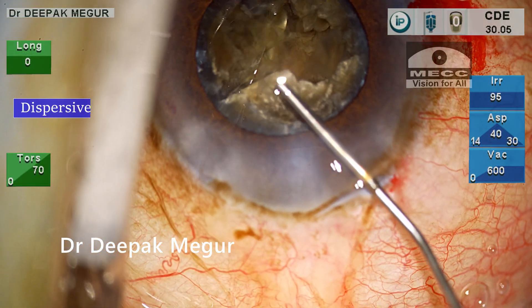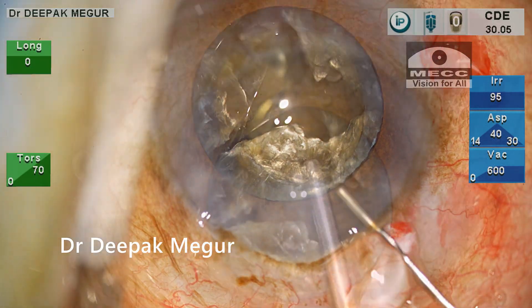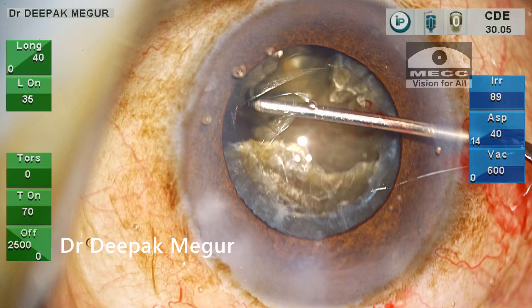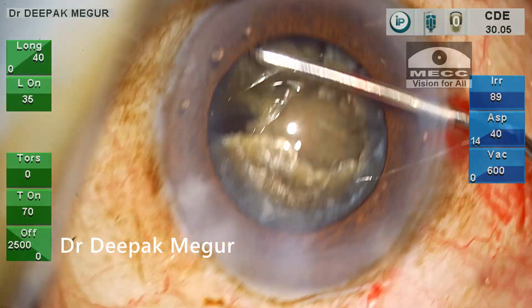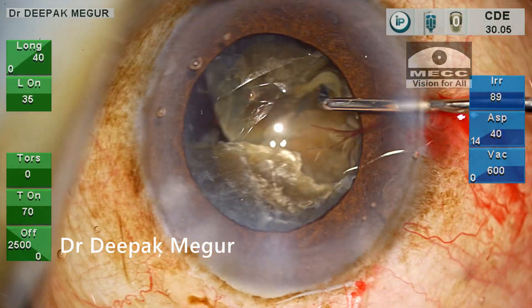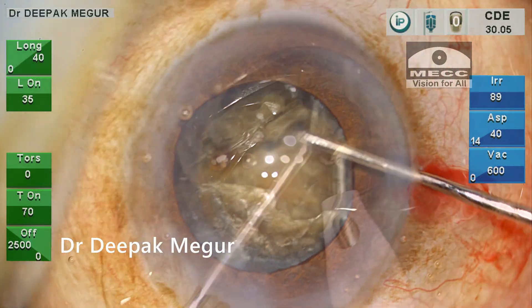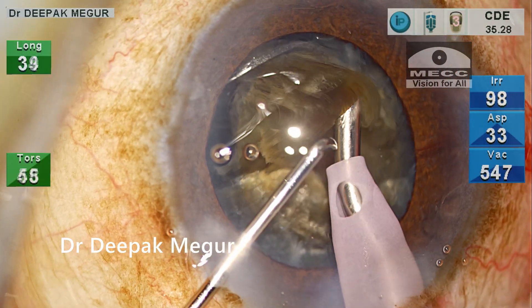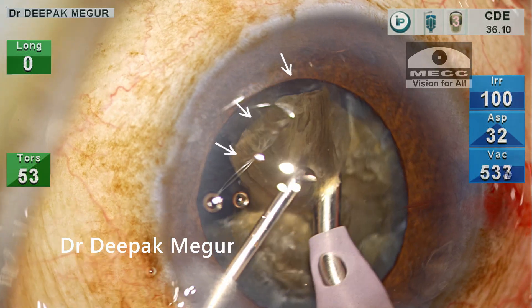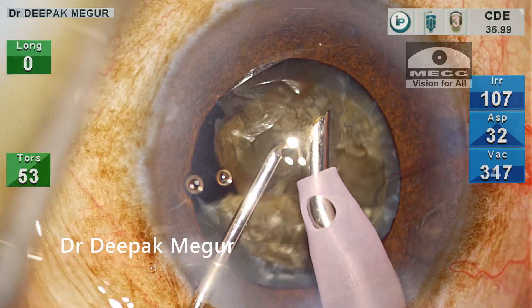I'm injecting dispersive OVD, underneath which I'm injecting hydroxypropyl methylcellulose (HPMC). HPMC is less thermogenic, so I prefer to put it in the bag and around the pupil, while the dispersive OVD is placed more anteriorly, nearer to the cornea. I use my chopper to cut the few remaining connections of the posterior plate of the fragment, and once freed, I begin emulsifying it. Part of the fragment is brushing around the rhexis margin, confirming the posterior plane of emulsification.